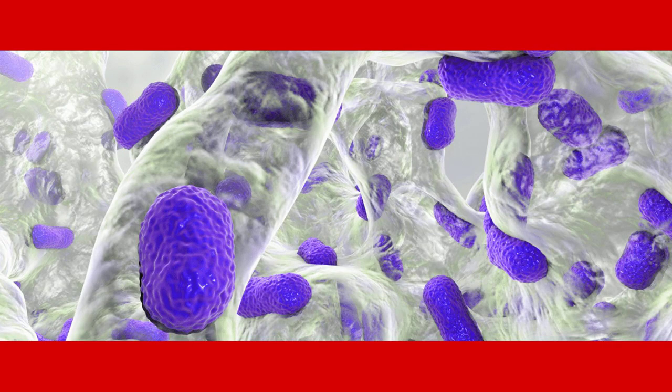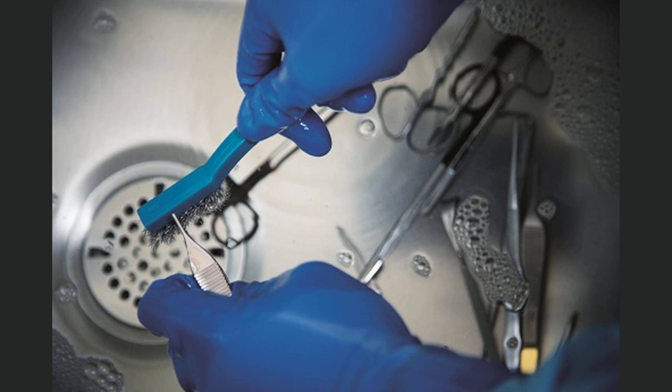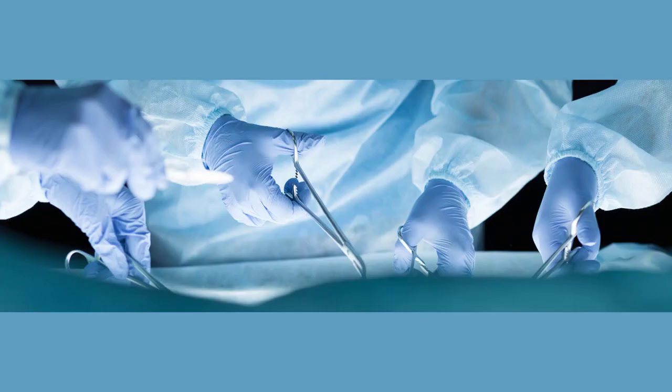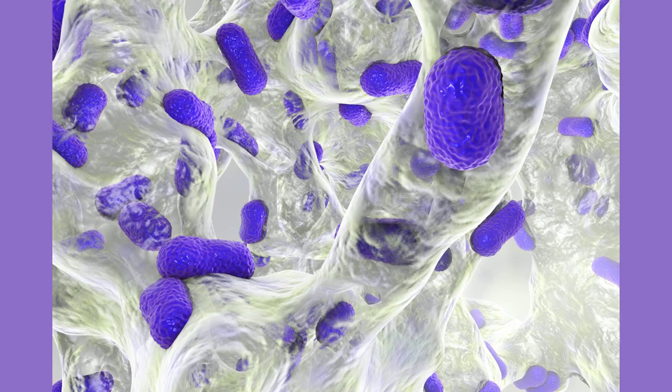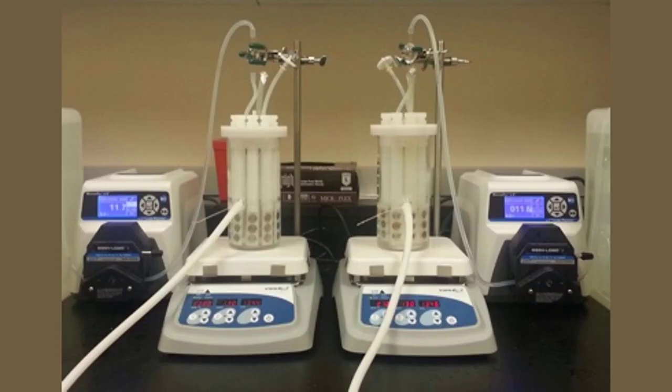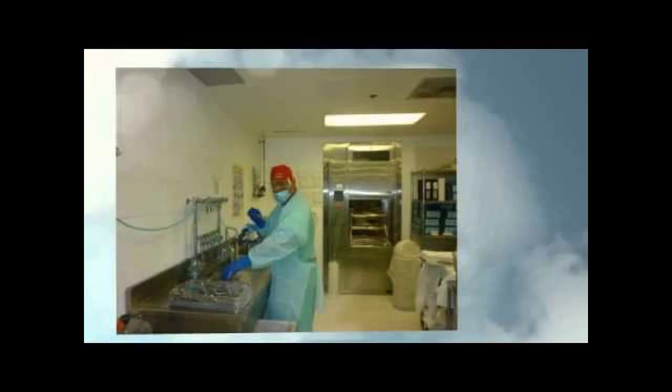Once it's on equipment, it's challenging to get it off. It's resistant to most antibiofilm treatments, making it almost impossible to handle. Usually, medical facilities resort to simply replacing contaminated instruments because it's more efficient. Biofilm's role in surgical equipment cleaning revolves around its stubborn nature. It's challenging to get rid of and can significantly impact a patient's health and a facility's budget, an unpleasant combination.